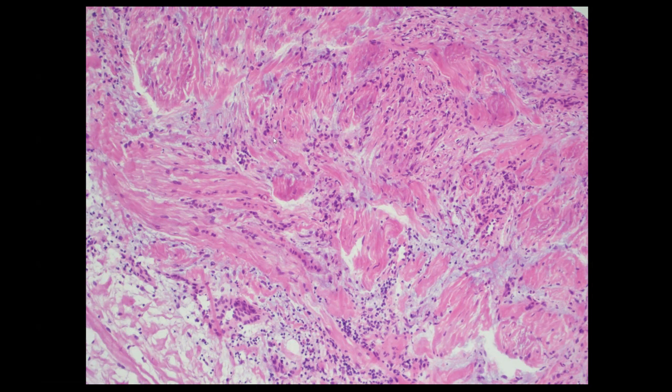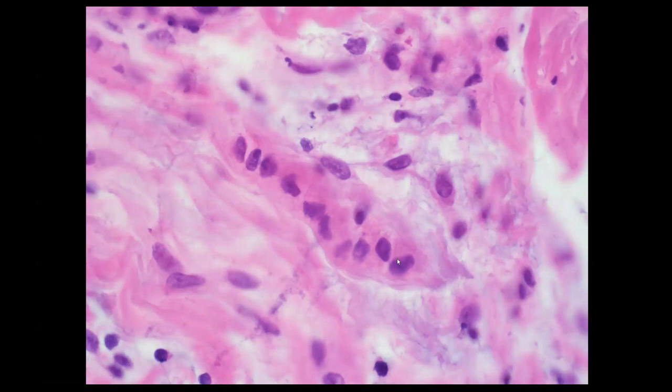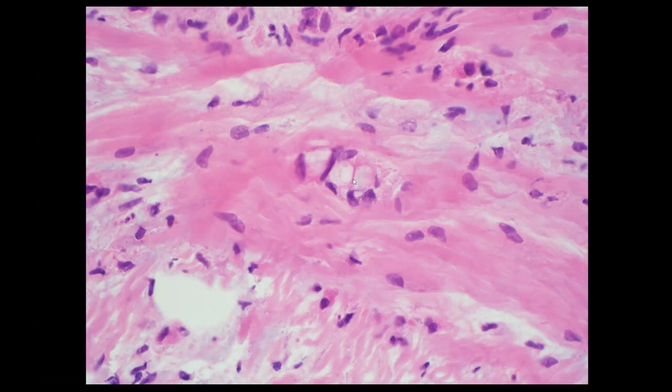You see here the skeletal muscle that is fibrotic and diffusely infiltrated by these cells that could be either histiocytes or malignant cells. And there are lots of sprinkled lymphoid-looking cells in the background. This can be really, really hard on frozen. Now what are you going to do? You look closely and you see that some of these cells are making files and have atypia, some prominent nucleoli here and there, and irregular nuclear outlines. Some of them have mucin. So by this time, you should be really worried that this is probably malignant.